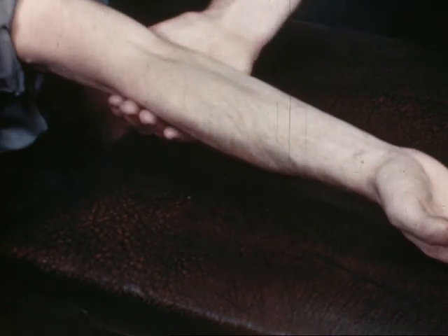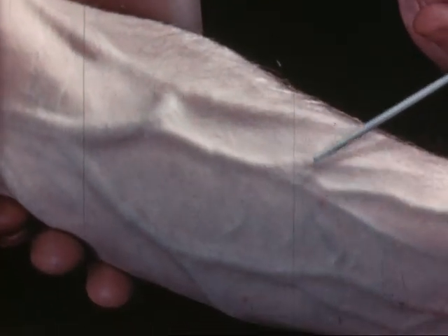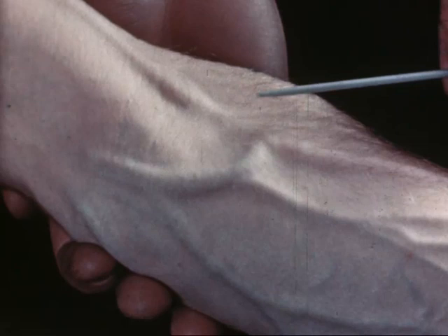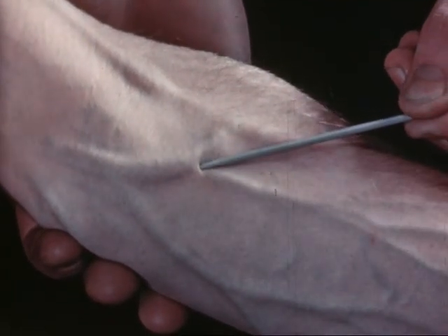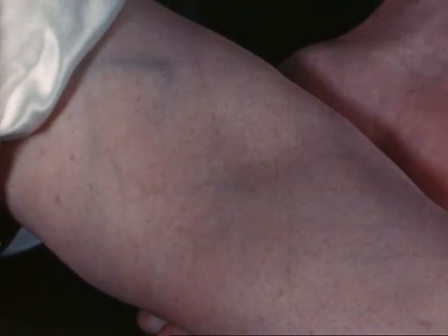It's of great importance to choose a good vein. The veins in the antecubital fossa are generally the best — they are prominent and usually well fixed by connective tissue. These superficial veins are far too mobile; they tend to slide away from the needle. Here a superficial vein bound down by connective tissue is the puncture site of choice. Some prefer to use the point of branching as there is less likelihood of sideways movement. Fat arms are often very difficult — superficial veins are too small and suitable ones lie much deeper, discoverable only by careful palpation.